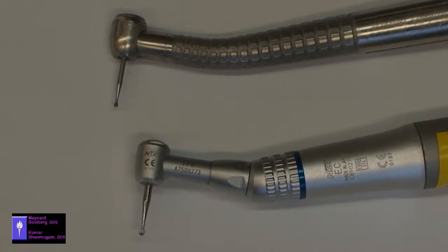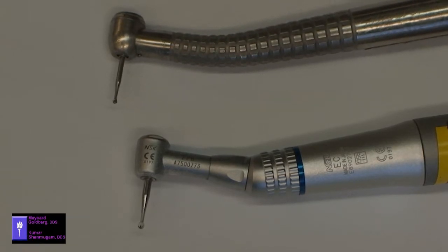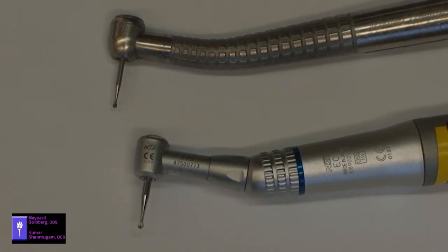To gain access, one can use either a slow-speed handpiece or a high-speed handpiece. For this demonstration, we've used high-speed and low-speed. And you will notice that when we use low speed on Ivorine models, we do get a smoother preparation. Therefore, it is recommended that you use slow speed for the Ivorine models or the Ivorine blocks. Use high speed when working on natural teeth.